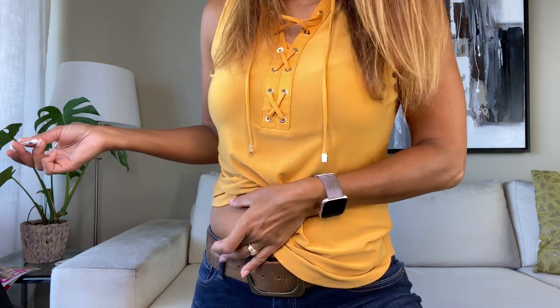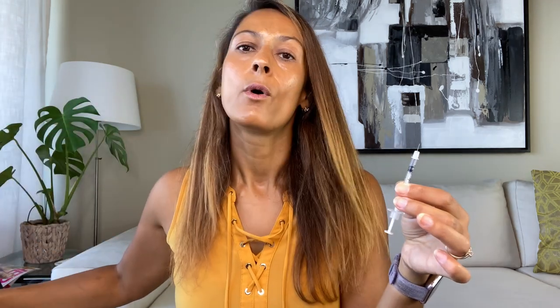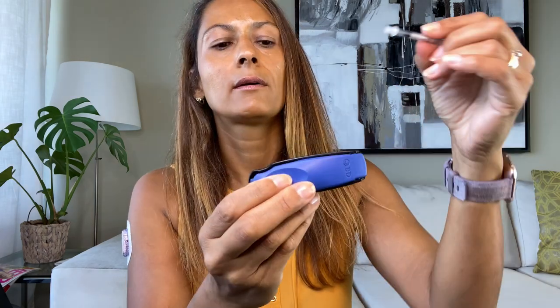Once you're done, pull out completely — no blood, nothing — and the insulin injection is done. You now have a syringe with a needle on it that needs to be disposed of properly: not in the trash, not in recycling. Use a store-bought or homemade sharps container, or a BD needle cutter — basically a tiny sharps container. Put the needle in, press, the needle is gone, and you can dispose of the cutter in the trash. That is how you do a 45-degree angle skin-fold injection using a longer needle.